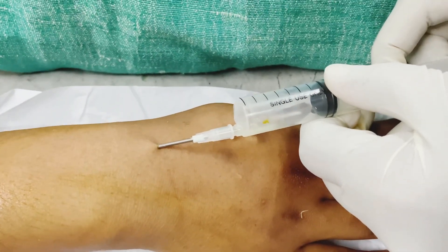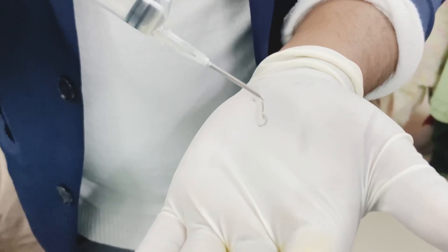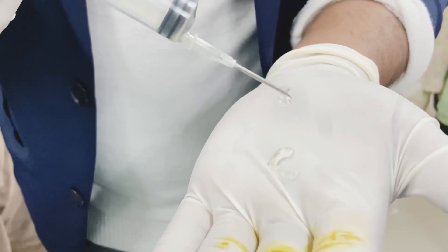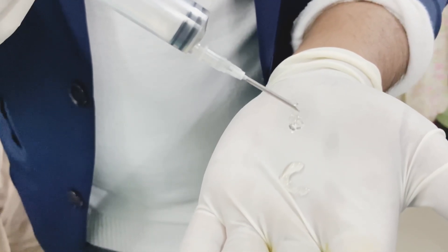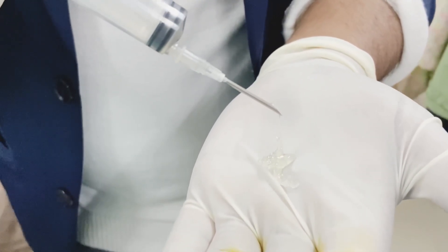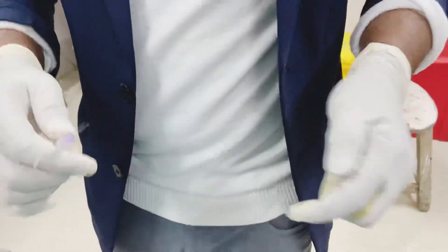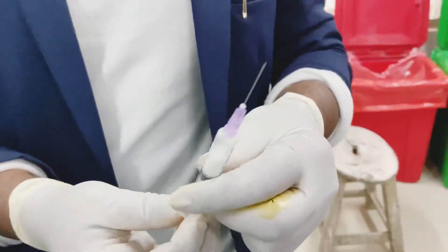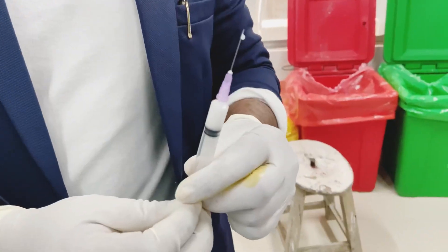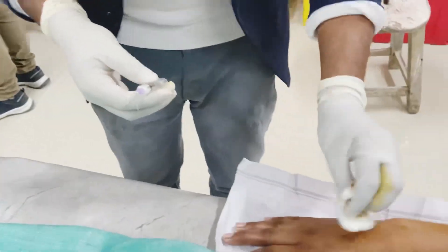You can change the needle direction if the content is not coming out. The content is clear and highly viscous, mucin-like jelly. Now I will infiltrate the sac with 1ml of 40mg triamcinolone.